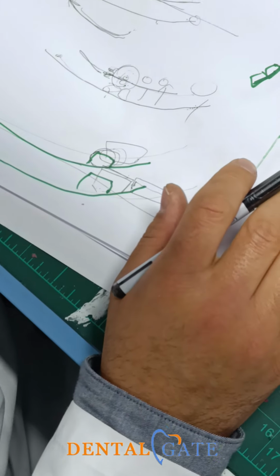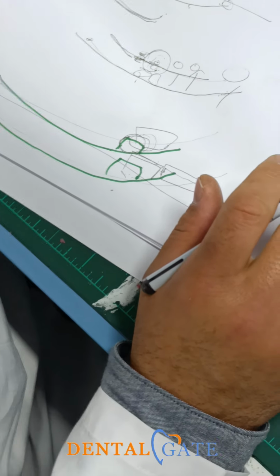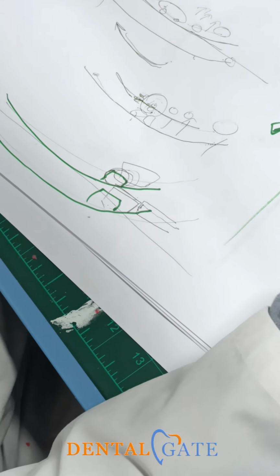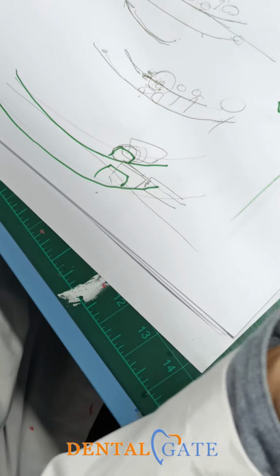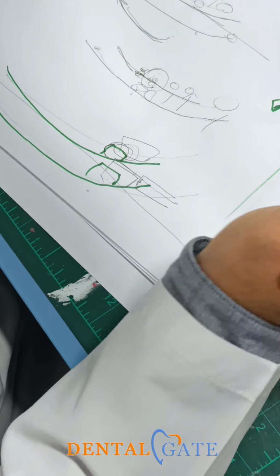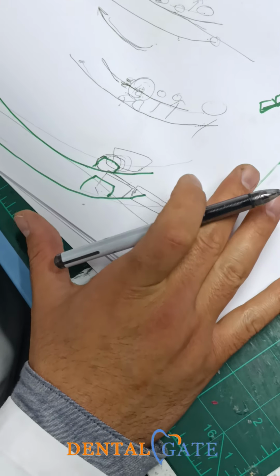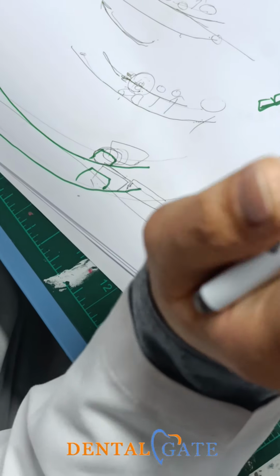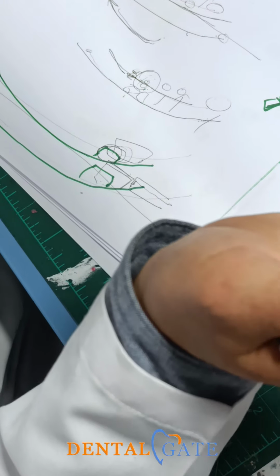Other one, these criteria regarding the inclination, I need to make it regarding what? To the mandible movement. Because I have a curvature plane within the movement. It is not severely obvious to the eye, but it's the normal movement of the mandible. It should follow the curve, okay?